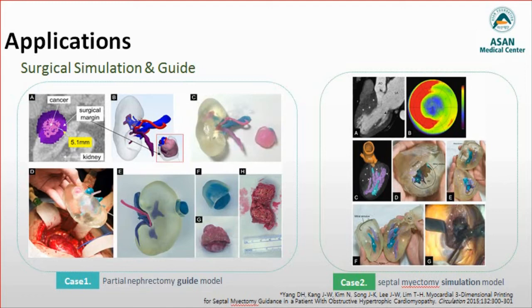The 3D printed phantoms were used to improve surgical outcome and have the potential to improve patients' understanding of their disease and improve satisfaction as well.